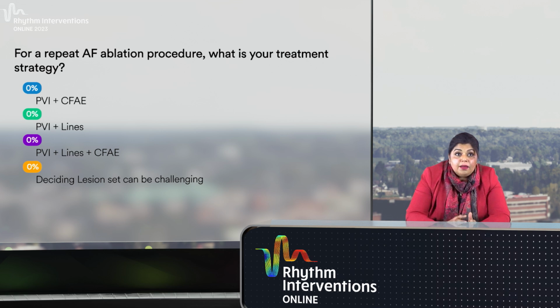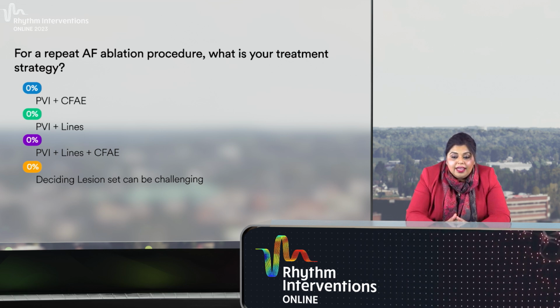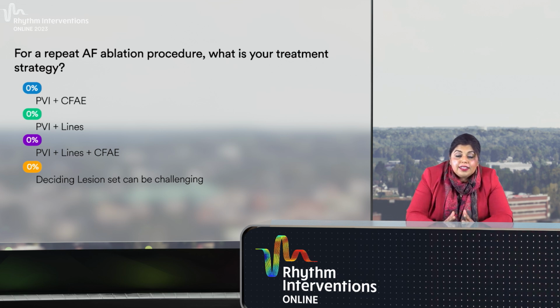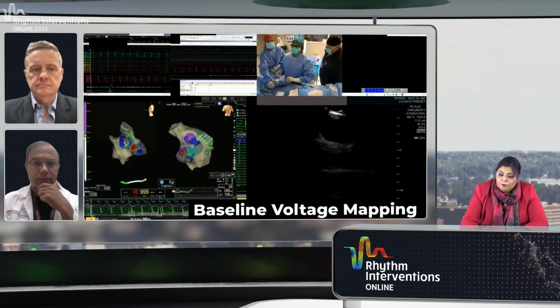Are you doing PVI plus lines? Are you making a combination of lines and CAFEs along with the PVI? Or is designing the lesion set more of a challenge and has to be more customized? Please vote on this poll question, and I'll go forward with the case presentation, and we'll come back to the answers of the poll.